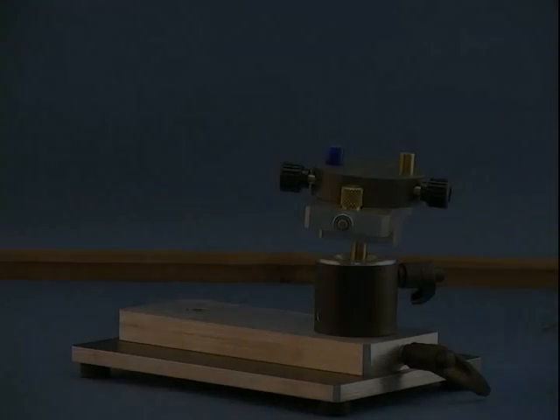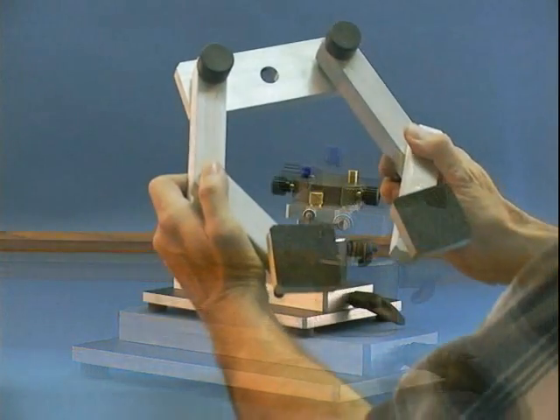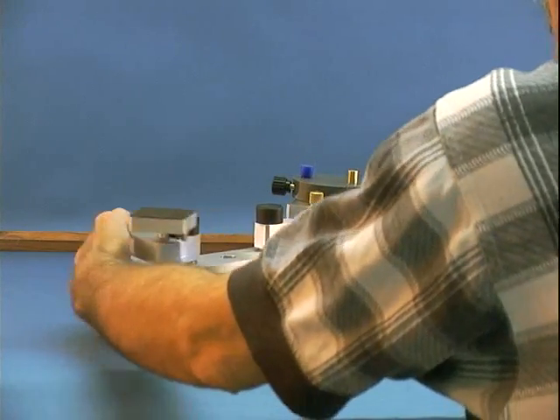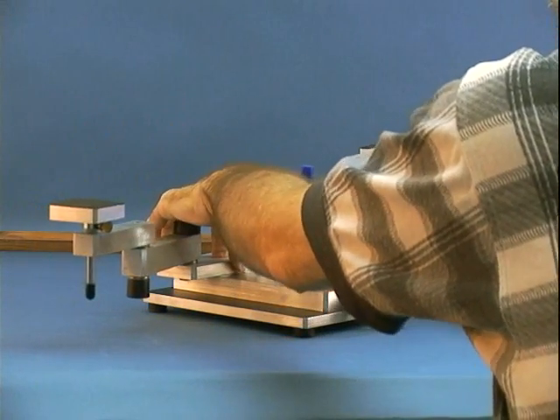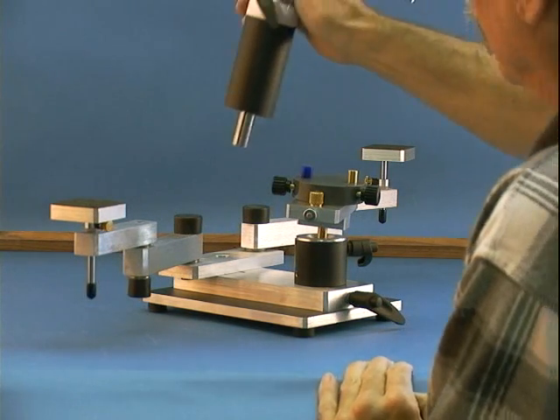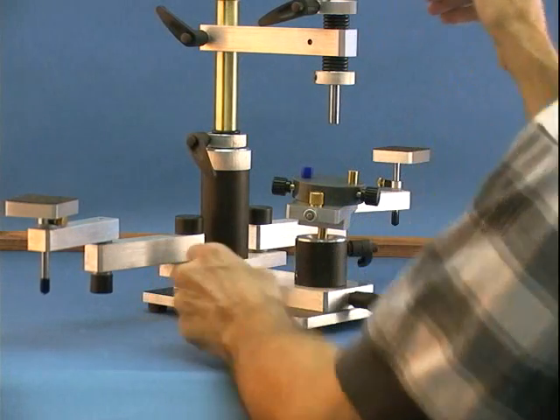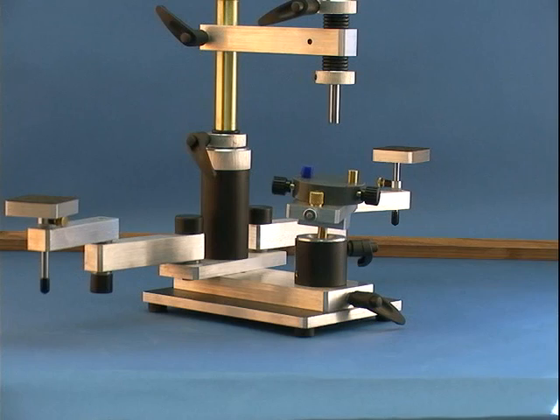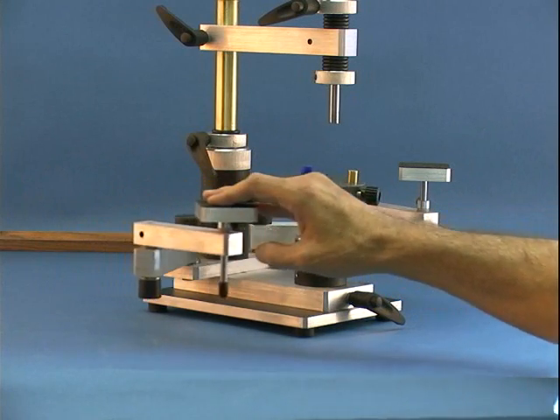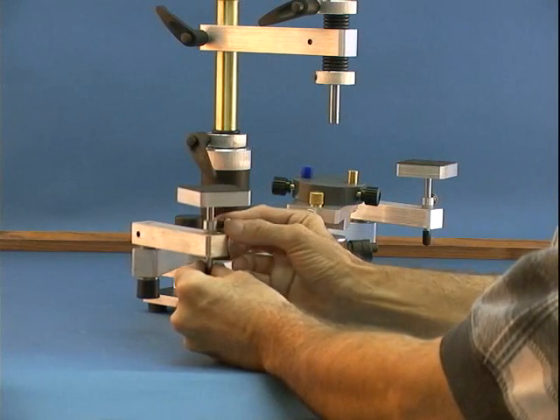Let's return again to the platform. We'll now install the handrest. Position the handrest on the platform so that the holes align. Next, insert the MX-5's column. Securely lock it in place with the two set screws on the backside of the base. We now have functioning and adjustable handrests.